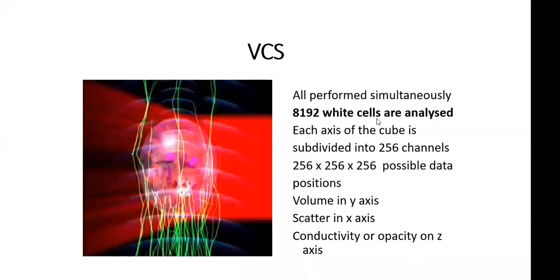You will be surprised to know that while doing a differential, we look at only 100 cells in the peripheral blood, but the machine, with the use of algorithms and various software, is able to differentiate 8,192 cells from each sample into various cell populations and divide them according to their volume, conductivity, scatter, or fluorescence into different axes.